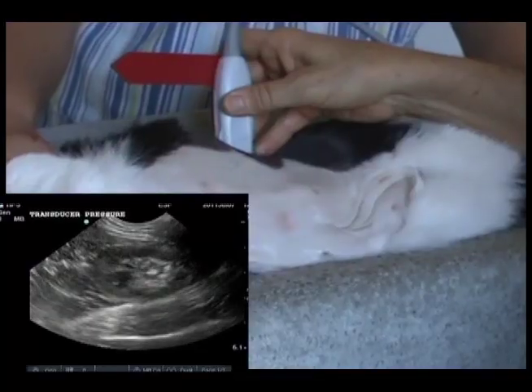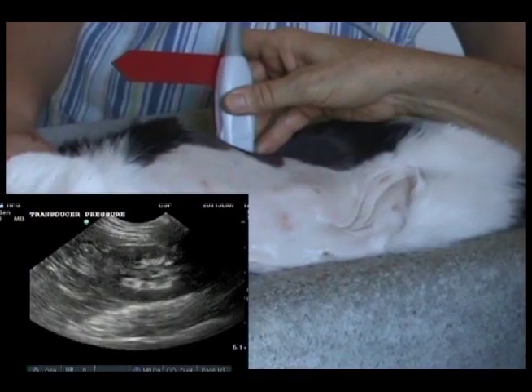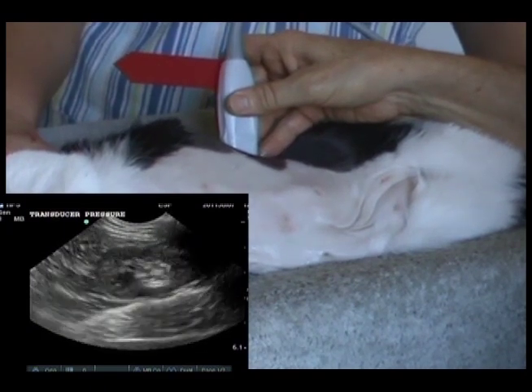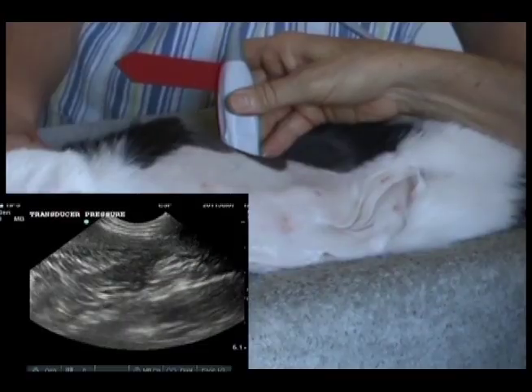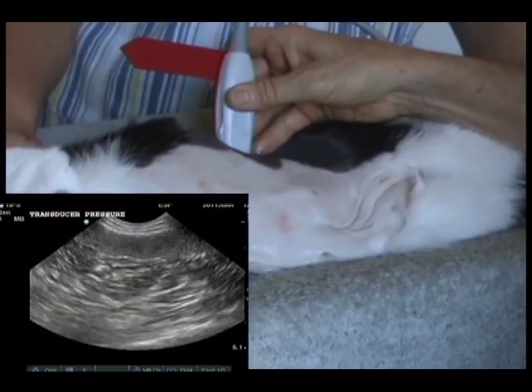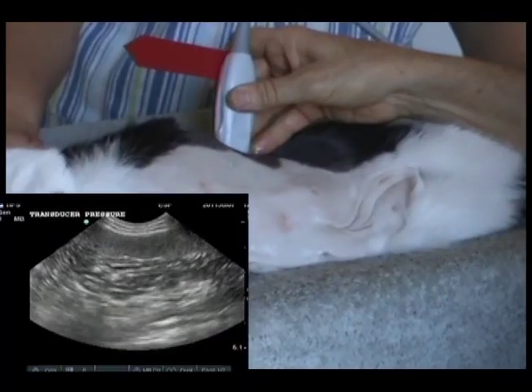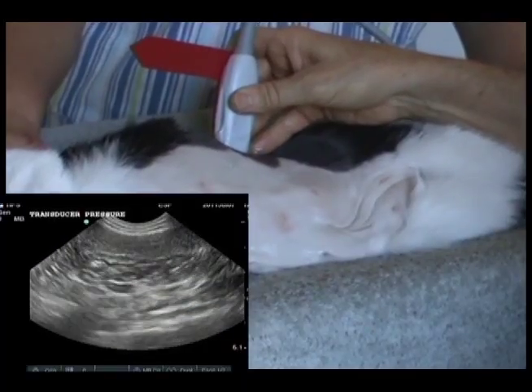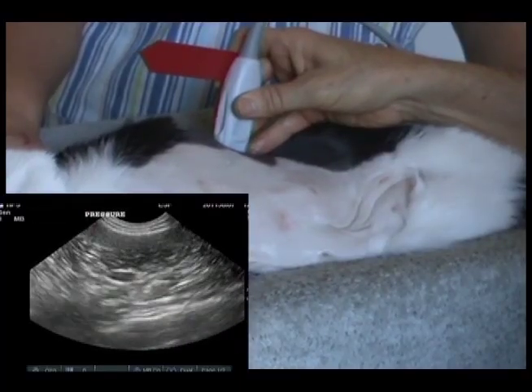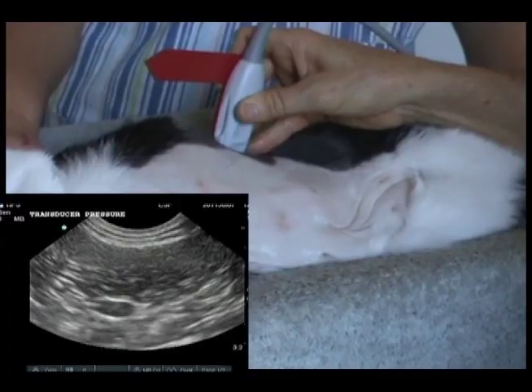When finished with the left kidney, the transducer is in a left lateral sagittal position bisecting the left kidney. Slide the transducer to the cranial pole of the left kidney to reduce edge shadowing. Fan very slowly ventrally and, if necessary, dorsally. The aorta and left adrenal gland should appear on the screen just cranial to the cranial pole of the kidney. Adjust depth to magnify the adrenal gland.